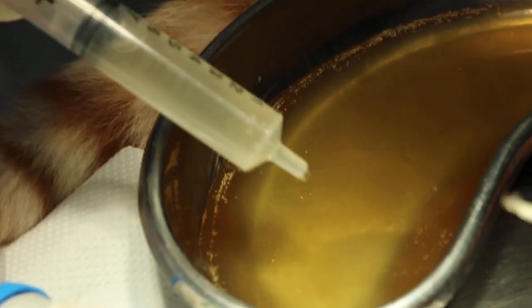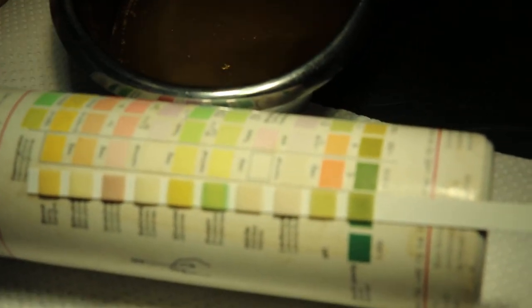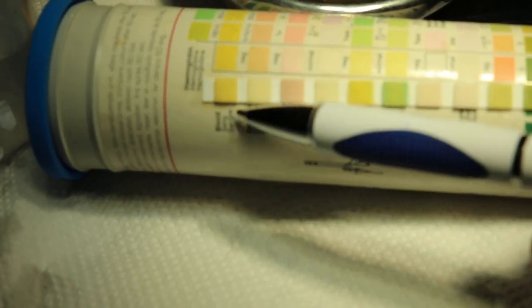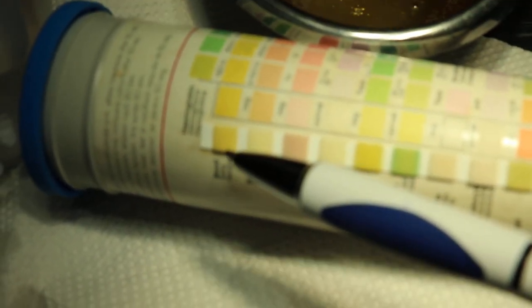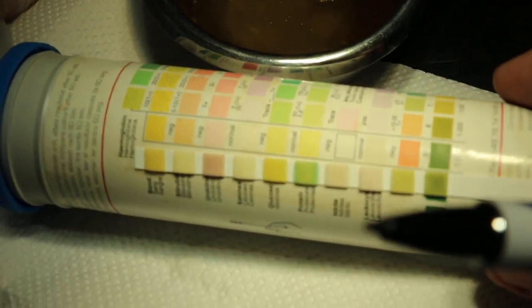Okay, now we are cleaning up the bladder. Now it's less cloudy. And SG, now SG I will put it as 1.020. Overall, the important thing is there is no blood. This one is negative. Yellow, you can see. Yellow without spots. It's plain yellow, which I'm rather surprised. Maybe there's some small amount of blood.